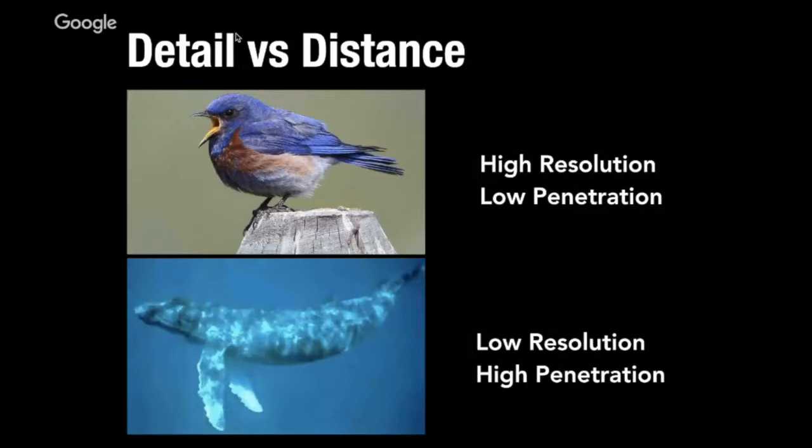It's always going to be the thing that I'm vibrating a molecule here, and the next molecule I'm going to vibrate is over here. And I can pass through substances to do that. High frequency sound, I'm going to vibrate a molecule here and a molecule here and a molecule here and a molecule here. If I hit a barrier, I'll vibrate some stuff in that barrier and I won't make it through. So the bass is coming through the car, and then the person inside wants to talk to someone and they roll down the window and it comes through, that was blocked before, right? So that's the high frequency, low frequency affecting your penetrance through substances.